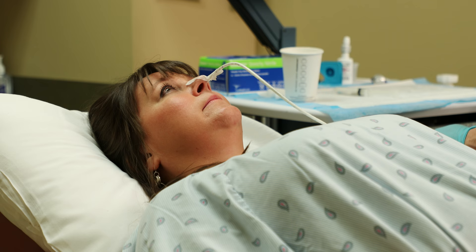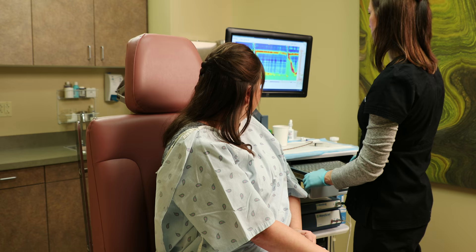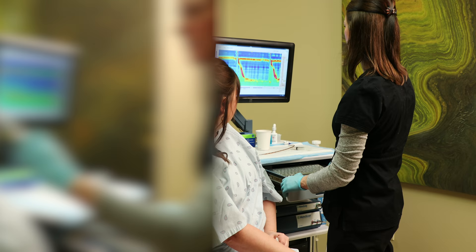The nurse will administer saline water throughout the test and you will be directed on when to swallow. You will be encouraged not to talk, cough, or swallow between each saline swallow. Once the desired number of adequate swallows has been obtained, the nurse will assist you in sitting in the upright position.